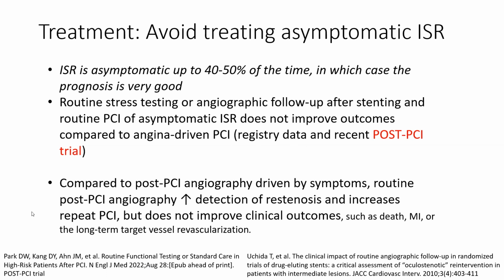And in many registry data, compared to angiography driven by symptoms, doing routine post-PCI angiography at 6 or 12 months increases the detection of asymptomatic restenosis and increases repeat PCI, but does not improve clinical outcomes such as death, MI, or long-term TVR. Again, that shows you that asymptomatic in-stent restenosis should not be treated at the asymptomatic stage.